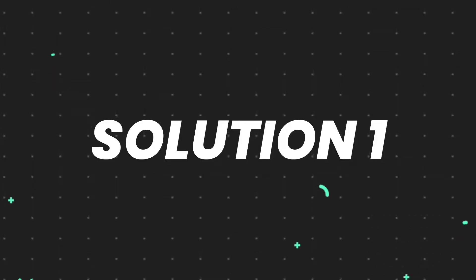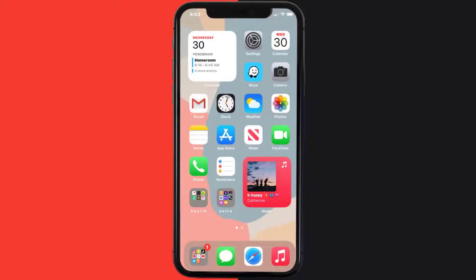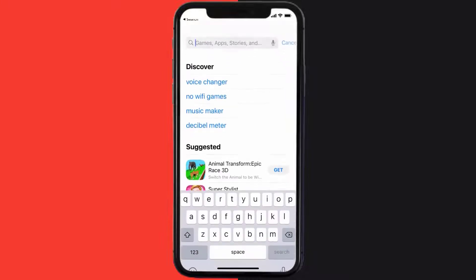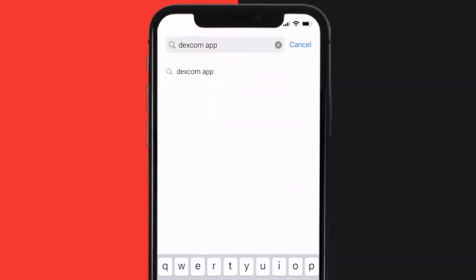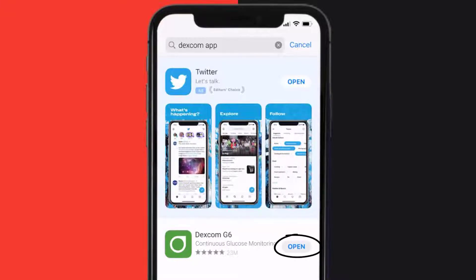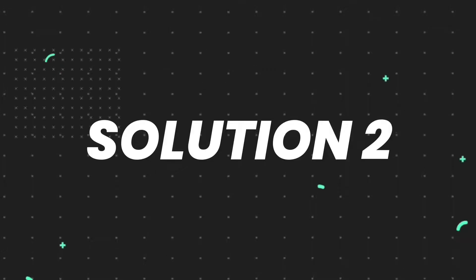So first of all, you need to make sure you're running the latest version of the app. Open up App Store on your device, and then tap on this search icon in the bottom right corner. Then search for the Dexcom mobile app, and if you see this update button right next to the app name, simply tap on it to make sure you're running the latest version of the app.